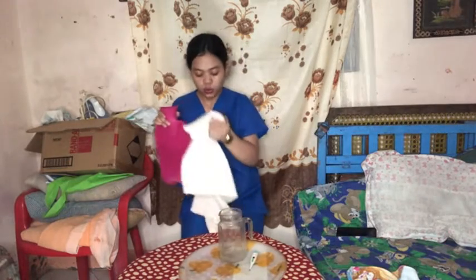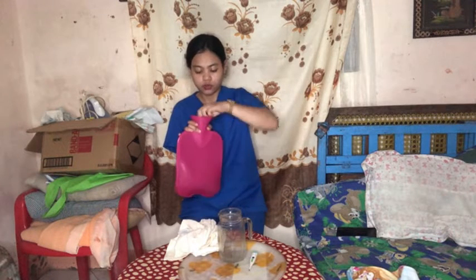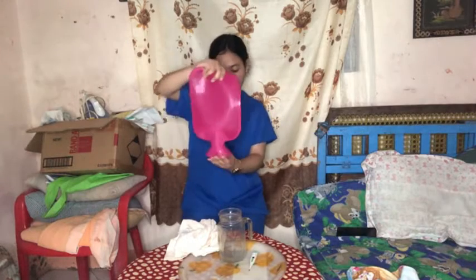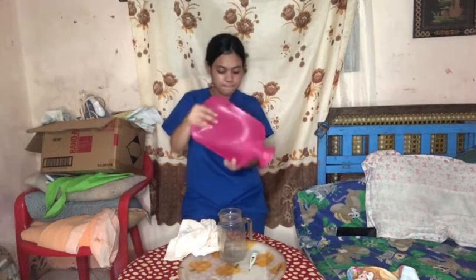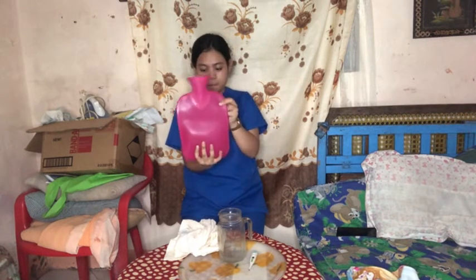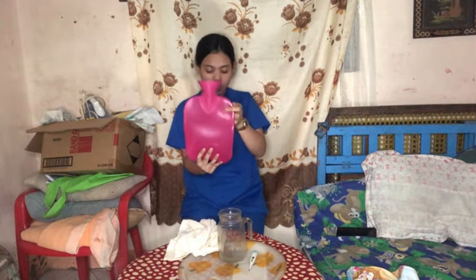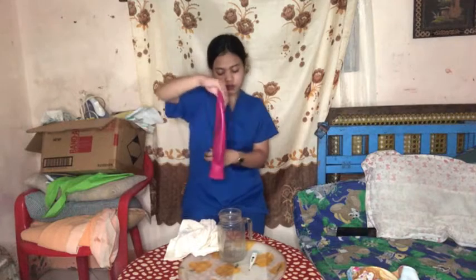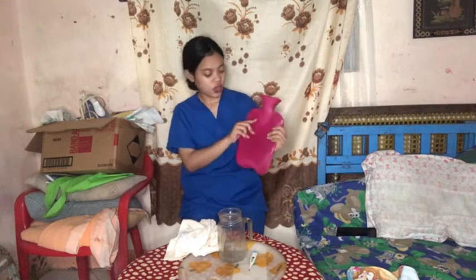Then we need to turn this upside down to check if there is a leakage. Okay, it's secured tightly and there is no leakage present.